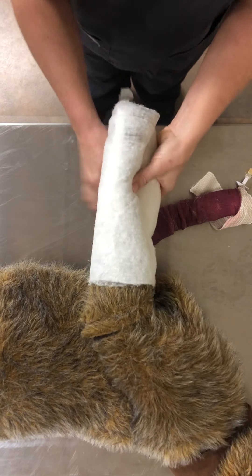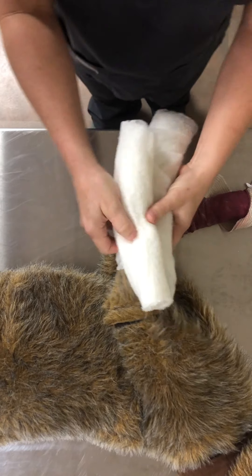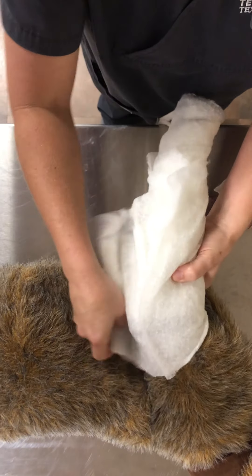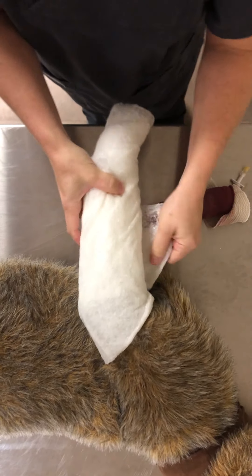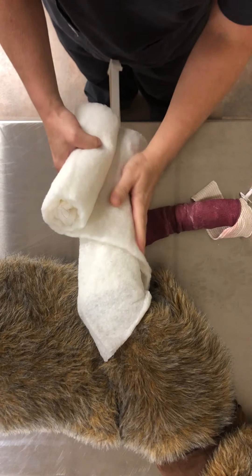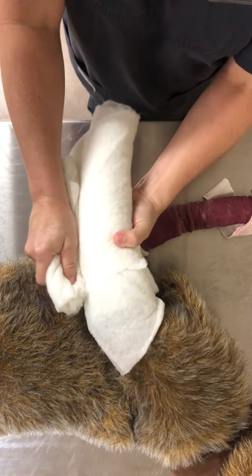Start with roll cotton at the foot. Wrap around, pull snug — as tight as you can get it. This material will tear before it gets too tight. For a radius ulnar fracture, you must immobilize the joint above and the joint below the fracture. To stabilize the fracture, we will need to go above the elbow. Robert Jones has a lot of layers of padding to compress and immobilize the limb.